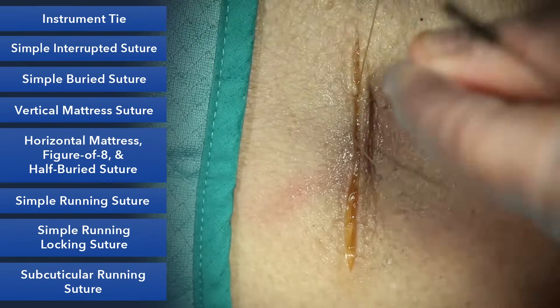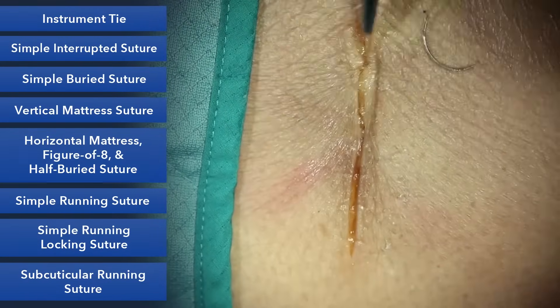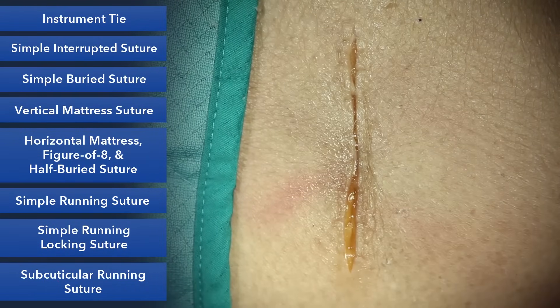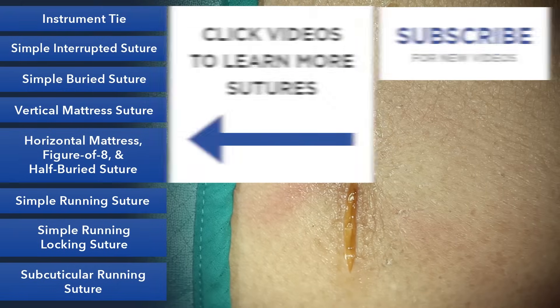Come back to the other side and back to the other side. And that is our simple interrupted buried suture.